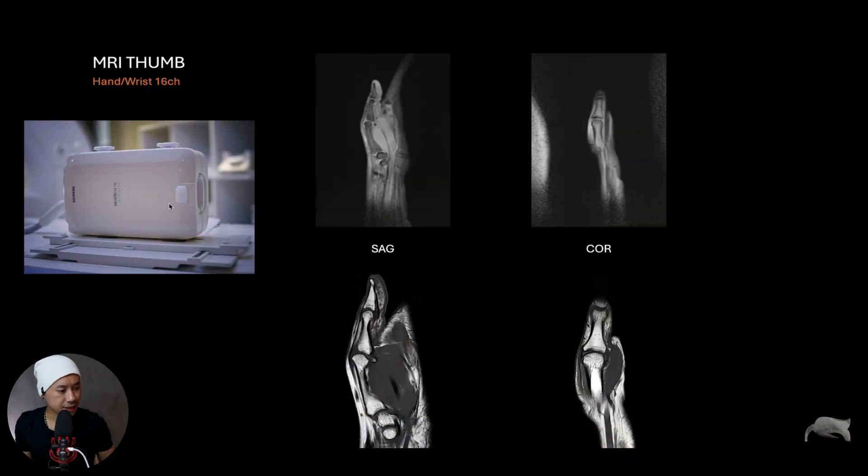As you can see here, this was done on a hand-wrist 16-channel coil — this is just a localizer. You can see the thumb is a little bit bent; it's not easy to straighten it out. I really want a straight thumb so it's easy to do the coronals, sagittals, and everything to get into the joints. So this is more or less routine, and I'll show you the issue.